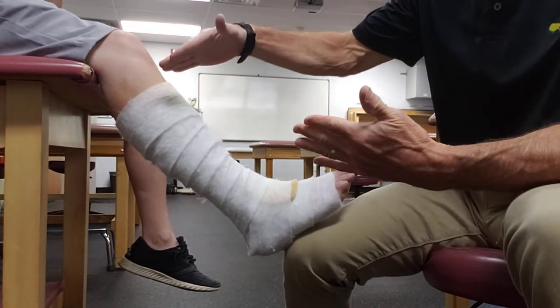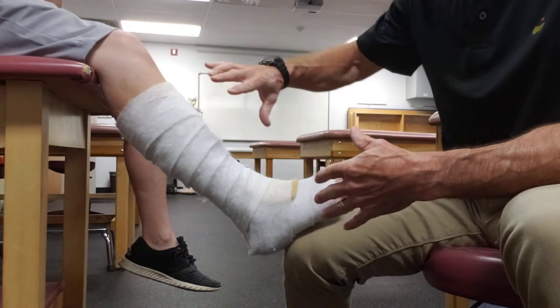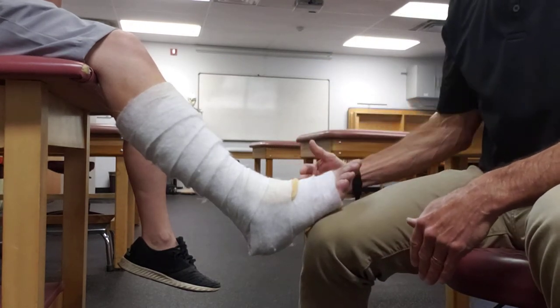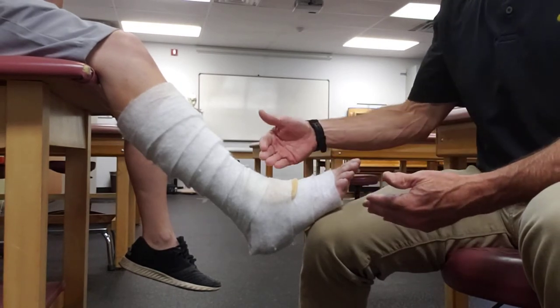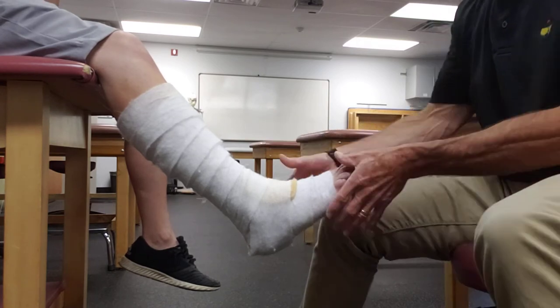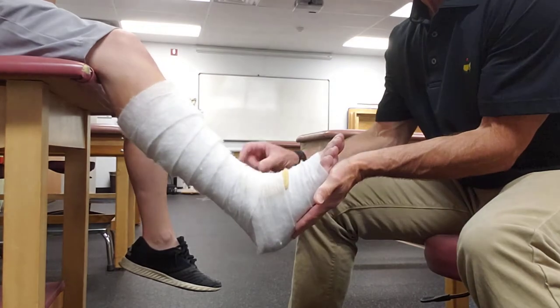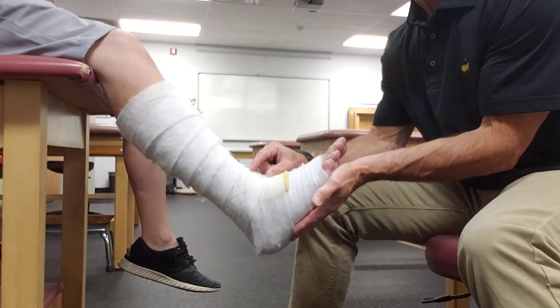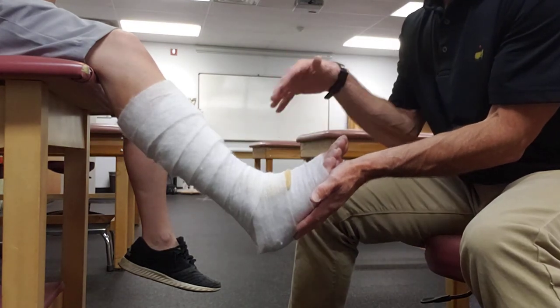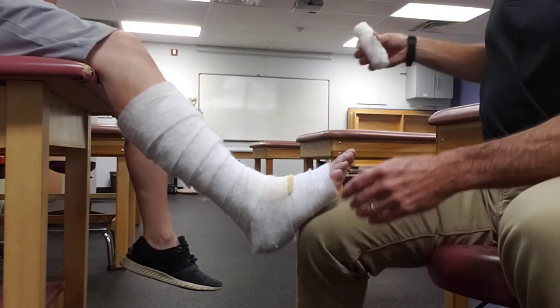You want the padding to end pretty much just below the fibular head, capturing all the lower leg. The patient should hold the foot at a 90-degree angle — you definitely want that. If the foot is in a plantar-flexed position when they go to weight bearing, all the material at the front will bunch up and create grooves, potentially digging in and irritating the skin. So try to keep them at about a 90-degree angle.